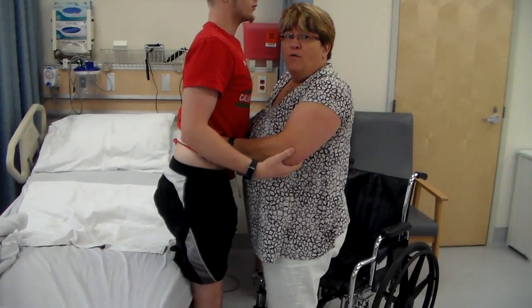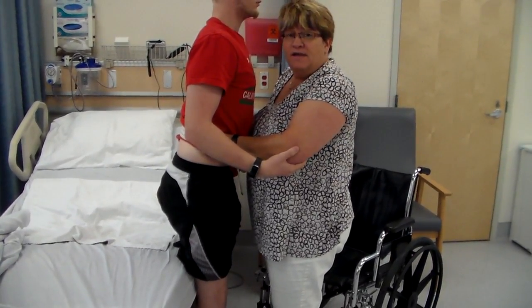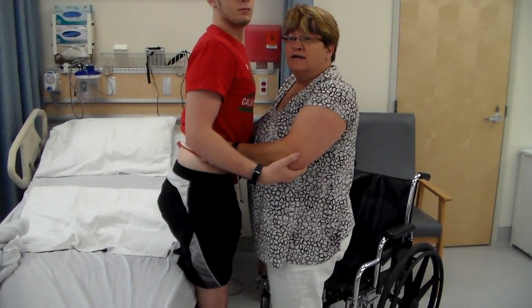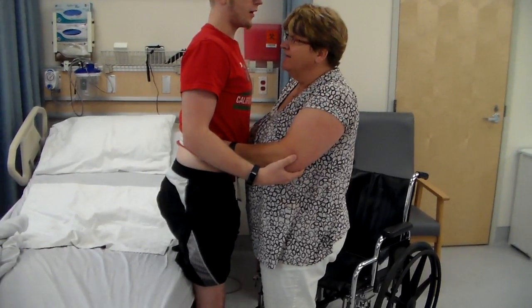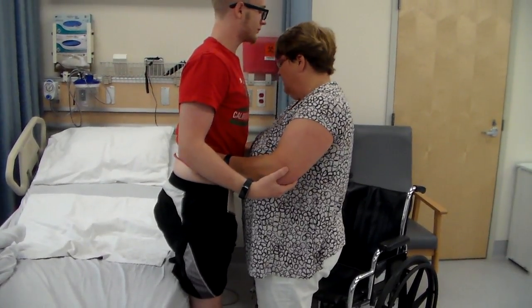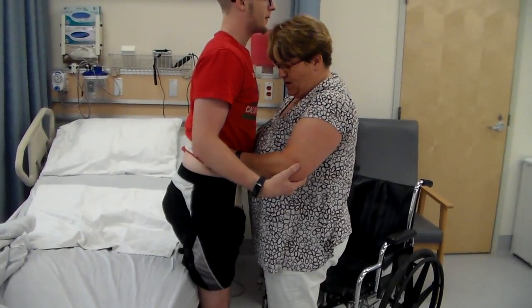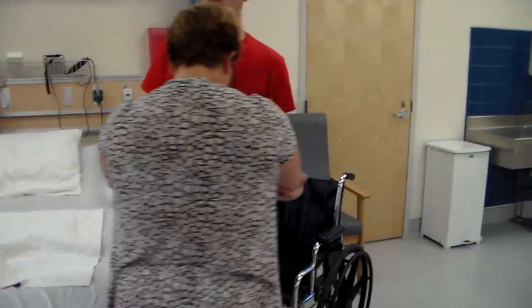So now, what happens to that blood flow again? That's right, they can become dizzy again because that blood flow's been disrupted again. So we're going to wait just a little bit. You're going to say, you feeling okay? I feel great. Okay, no dizzy? Nope. Okay. So what we're going to do is we're going to move over to this wheelchair. We're going to move this way. Okay? All right. All right, ready? 1, 2, 3. Turn. Turn.